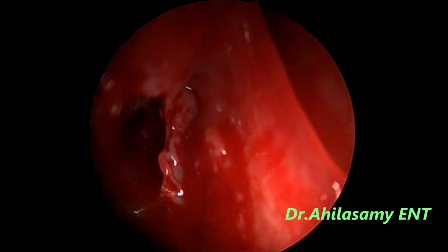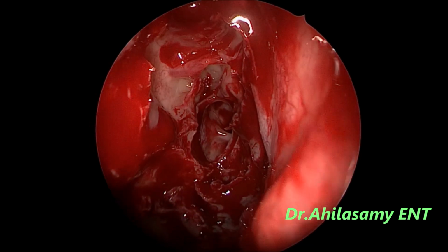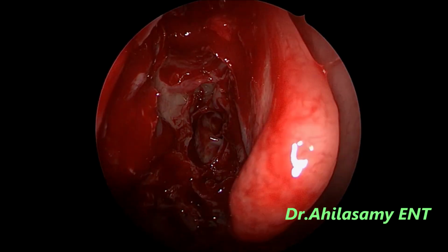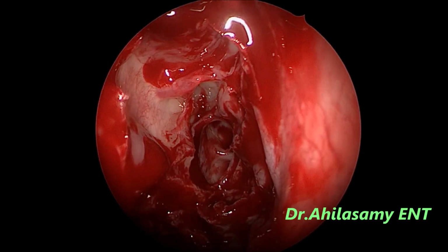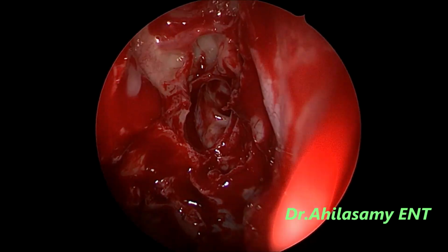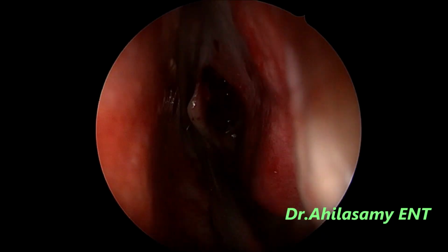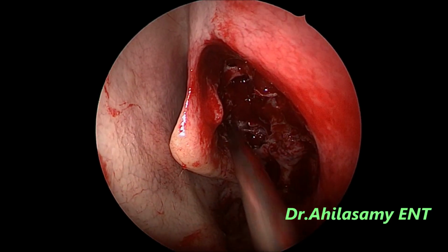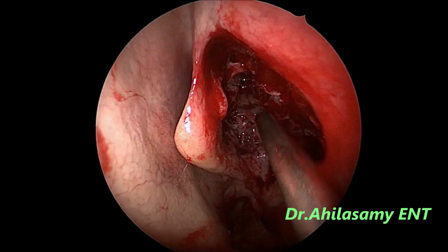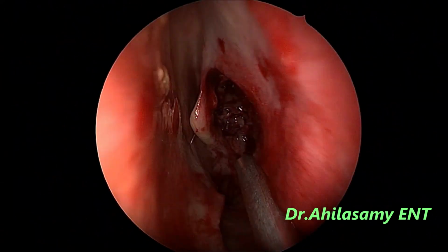See, the right frontal is also opened, hardly much disease there. Except the right sphenoid, which doesn't have much disease, all the sinuses have been opened, and a full bilateral FESS has been done. And you see hardly any bleeding, no destabilization of the middle turbinate, rock solid middle turbinate, and the patient is very happy with no pain during surgery. Loose bony chips, take them out.